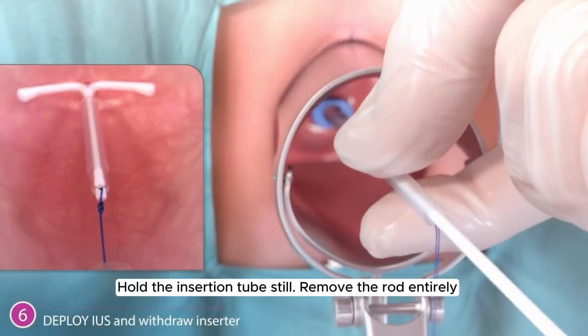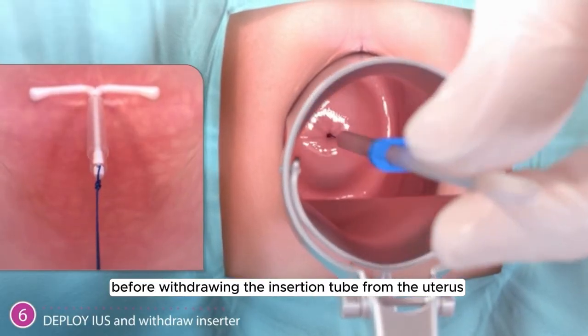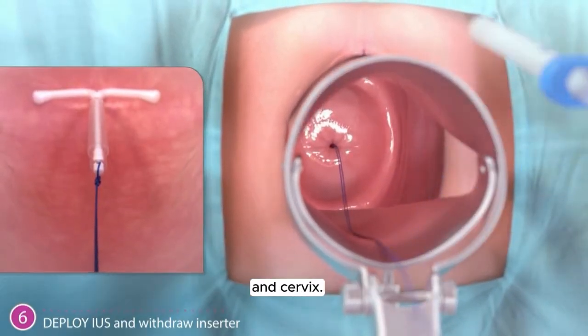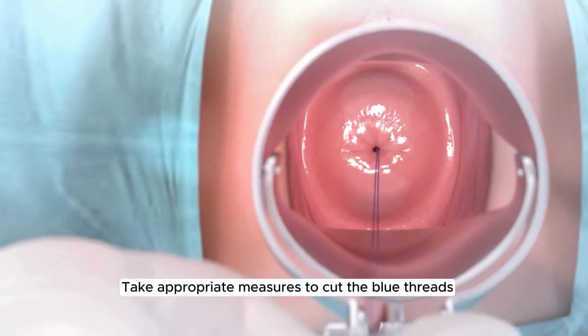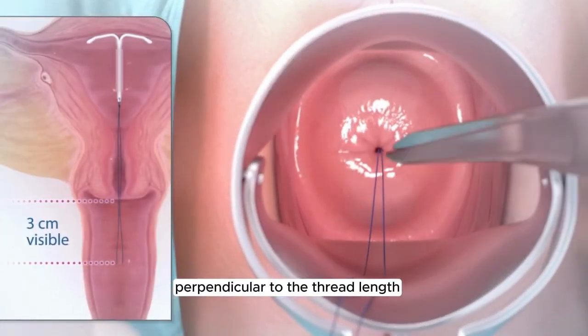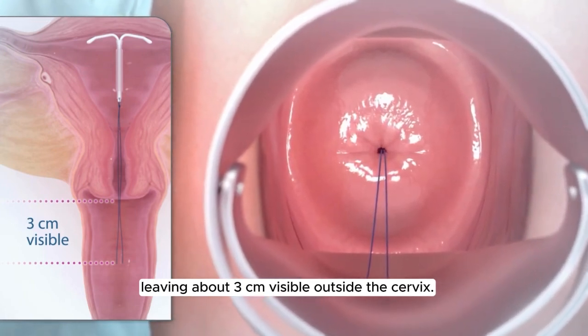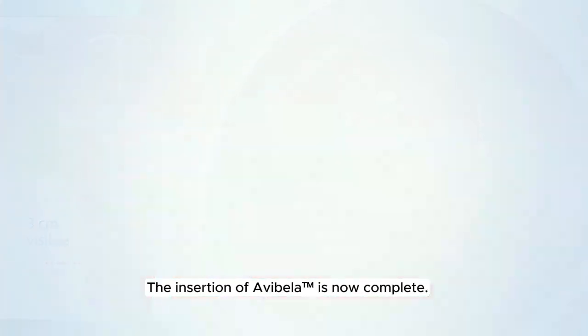Hold the insertion tube still. Remove the rod entirely before withdrawing the insertion tube from the uterus and cervix. Take appropriate measures to cut the blue threads perpendicular to the thread length, leaving about 3 cm visible outside the cervix. The insertion of Avibela is now complete.